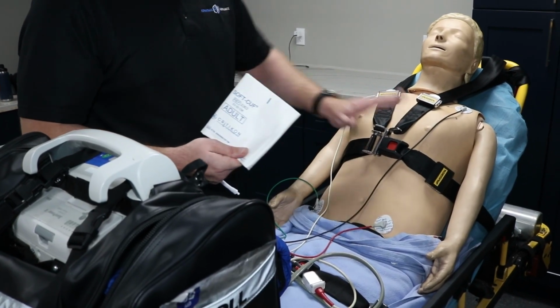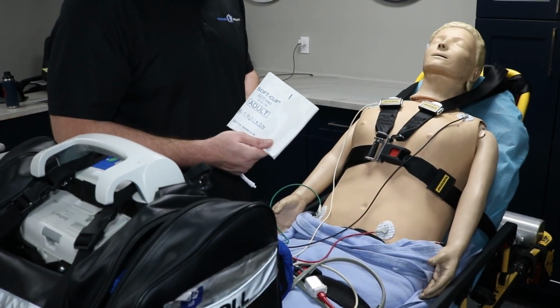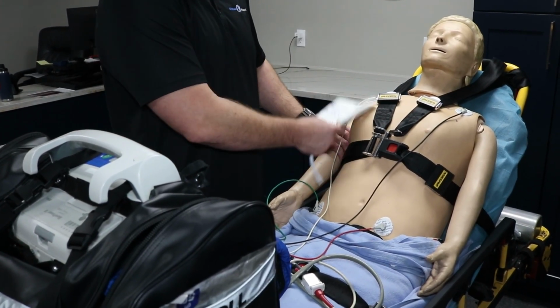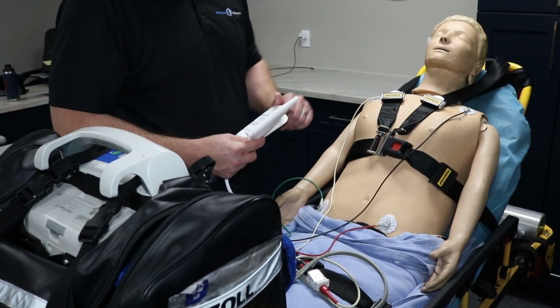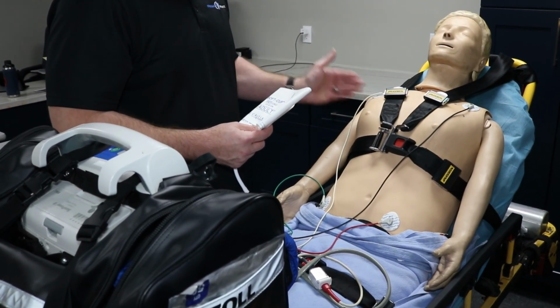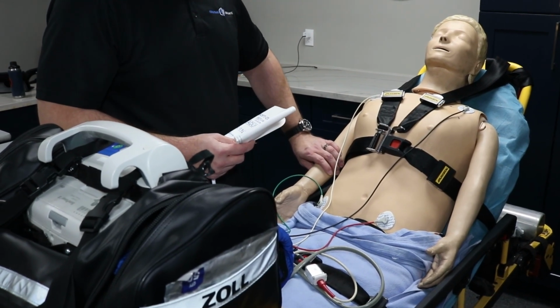Make sure that we check on the patient for any contraindications as far as what side we're going to be using. Make sure that they haven't had any previous surgery, vascular surgery, that's going to prevent us from utilizing blood pressure on either the right side or the left side, like a mastectomy, lumpectomy, lymph node surgery, or any dialysis catheters as well.